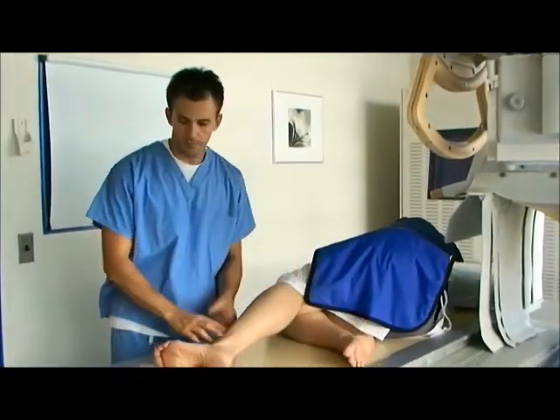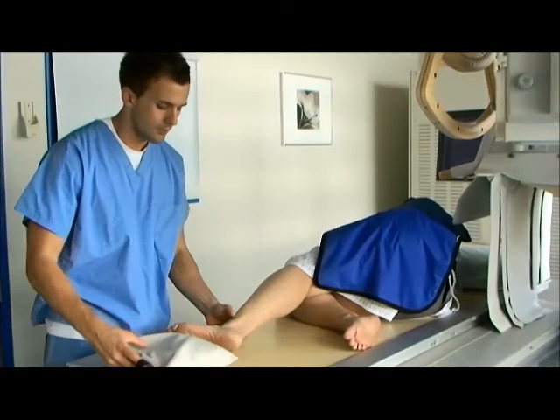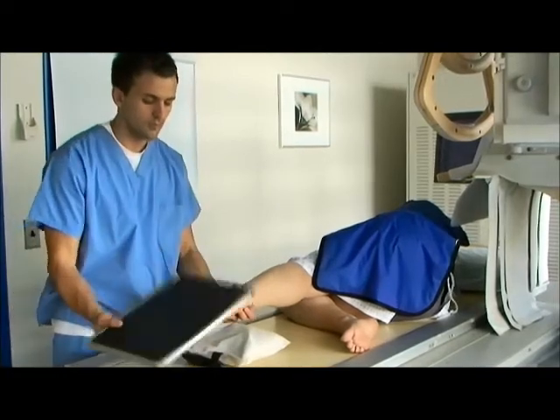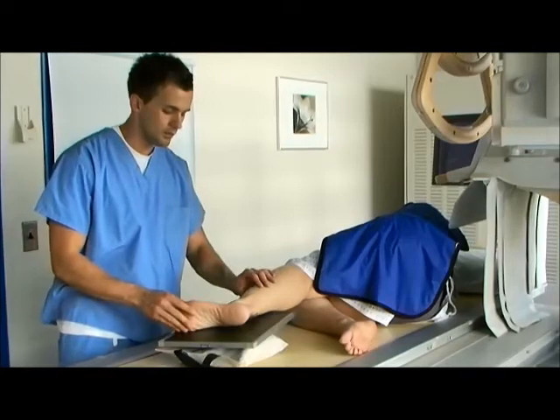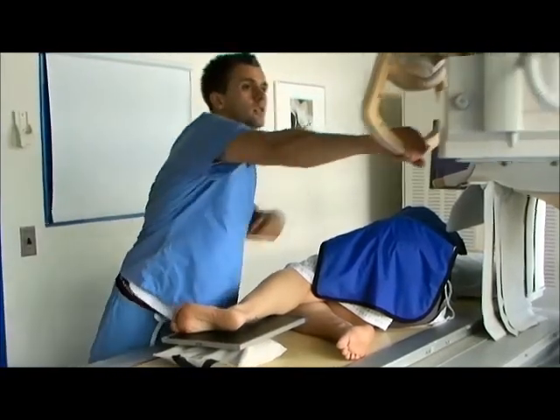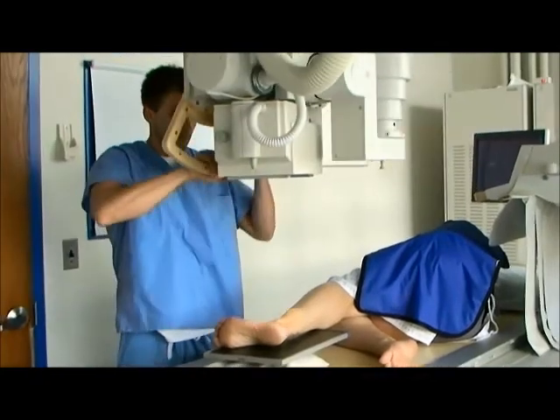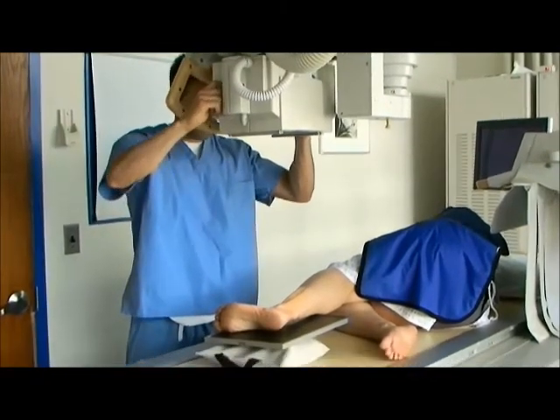Keeping the unaffected ankle out of the way by bending the knee, take a sandbag to build up the 10x12 cassette you will be using. With the foot slightly dorsiflexed and the ankle centered to the cassette, bring the tube directly over the ankle joint. The central ray should be entering perpendicular a half inch superior to the lateral malleolus at an SID of 40 inches.